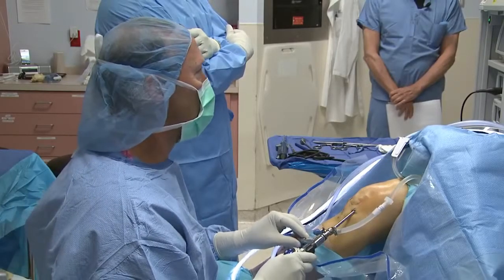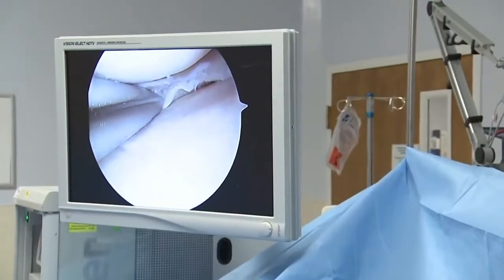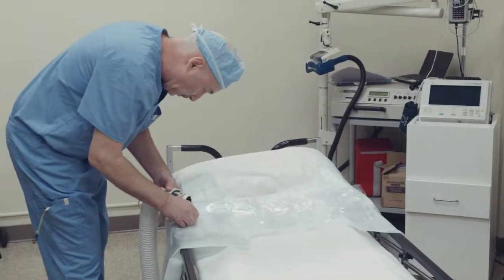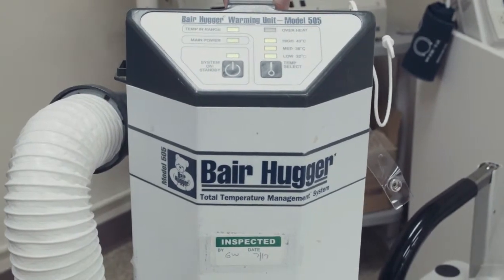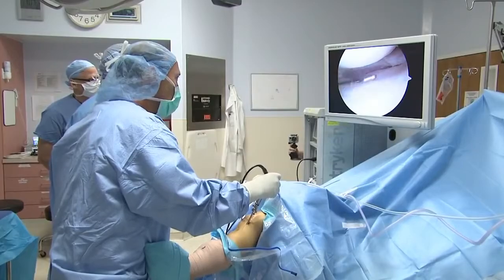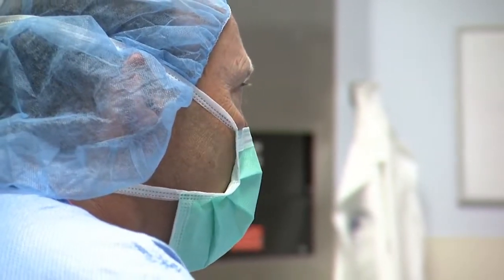Serious infections strike 12,000 surgical patients every year. Among the worst involve patients getting hip and knee surgery. The infections have many causes, but now over 4,000 lawsuits allege one cause is this heating blanket used in 80% of operations. You see, operating rooms are cold, good for surgeons, but bad for patients.